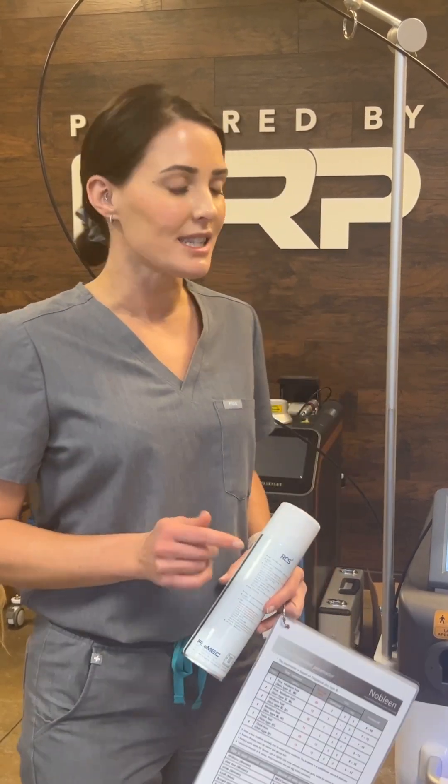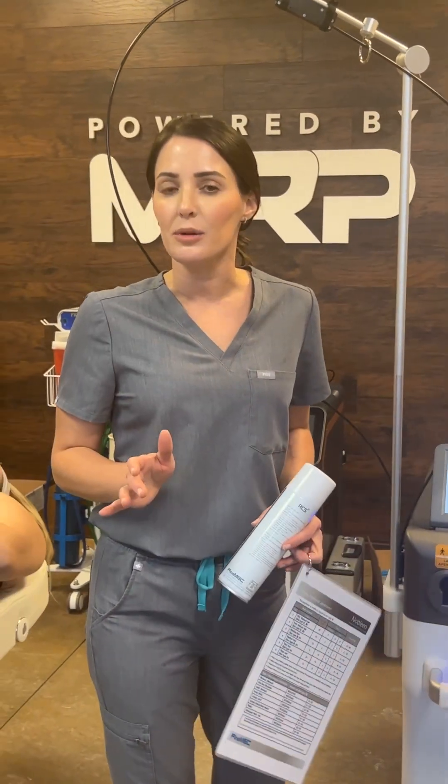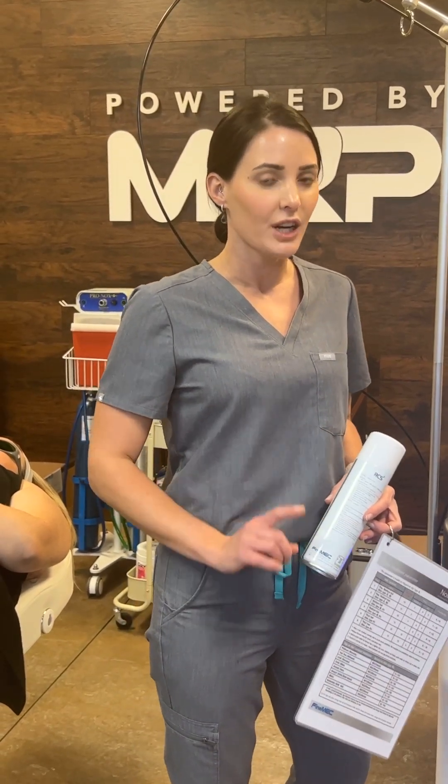Hi everyone! We have a new device by FineMEC called Nobleen. It is a long pulse Nd:YAG and also Alexandrite 1064/755, but what's great about this device is it also has the option for a fractional handpiece. We're going to go into a little bit more detail, but today we're going to do a hair removal treatment. I want to talk about the device first.